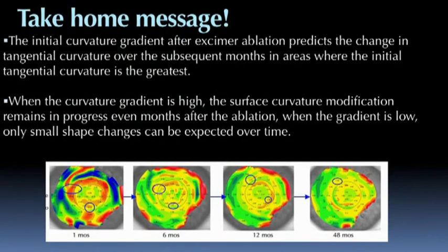Stability is a very important issue because if you correct the patient and after months they become myopic or hyperopic or astigmatic, the patient is not happy. Even promising a free retreatment is not satisfying for the patient. So the aim should be to hit the target in the first treatment. That is a good start because, first of all, you have no need of high nomogram adjustment in your treatment. The second is that the patient gets the target immediately. He does not have to wait months to be on target. And the third is the stability over time and the constant power of the cornea at different pupil sizes. That means that you do not perceive different quality between night and day.